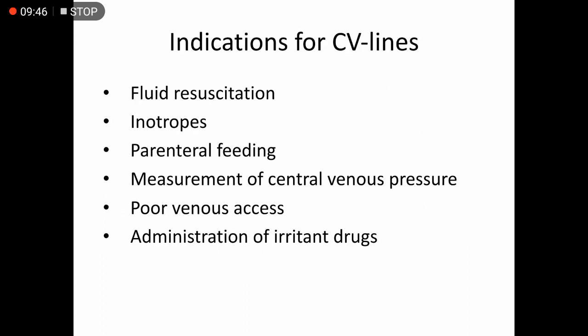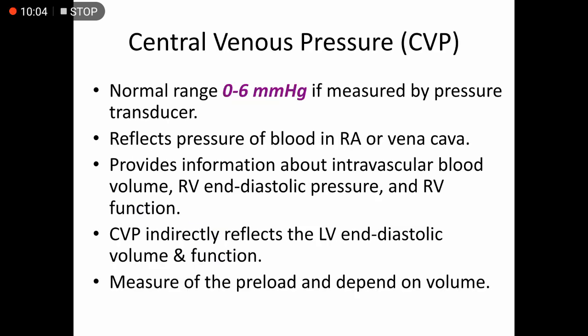Indications for a central venous line: fluid resuscitation, inotropes administration, parenteral feeding, measurement of central venous pressure, poor venous access, and administration of irritant drugs such as electrolytes.